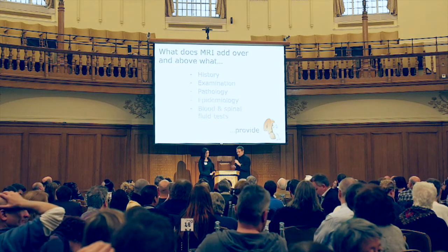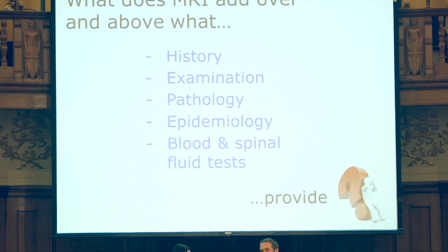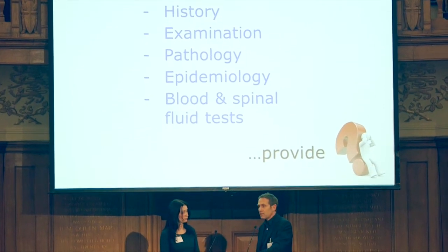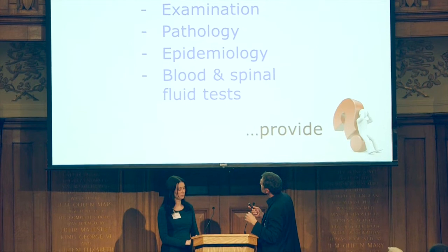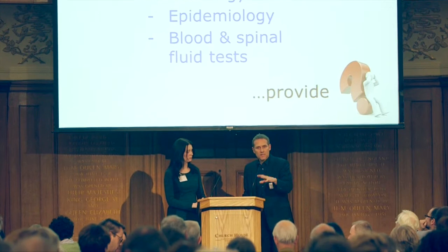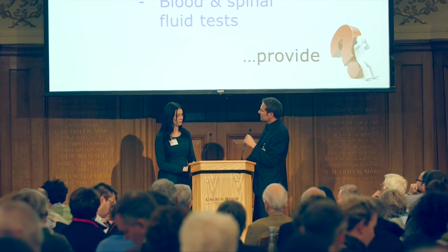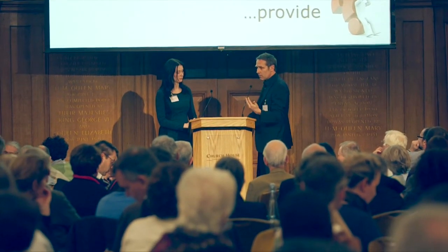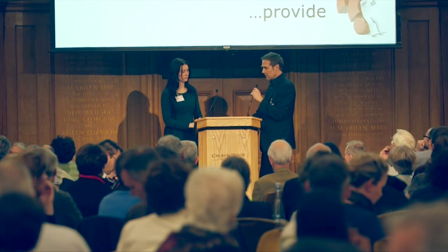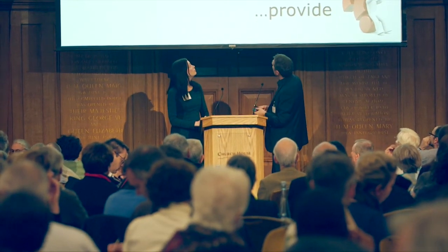And over the last 25 to 30 years, it has become apparent that MRI is particularly sensitive to multiple sclerosis, more so than any of these different approaches. And that applies particularly to two situations. One is the diagnostic scenario or diagnostic process, early on in the disease, and the second is to monitor the disease course, particularly when treatment decisions are to be made. And we'll give you an example each as we go along.